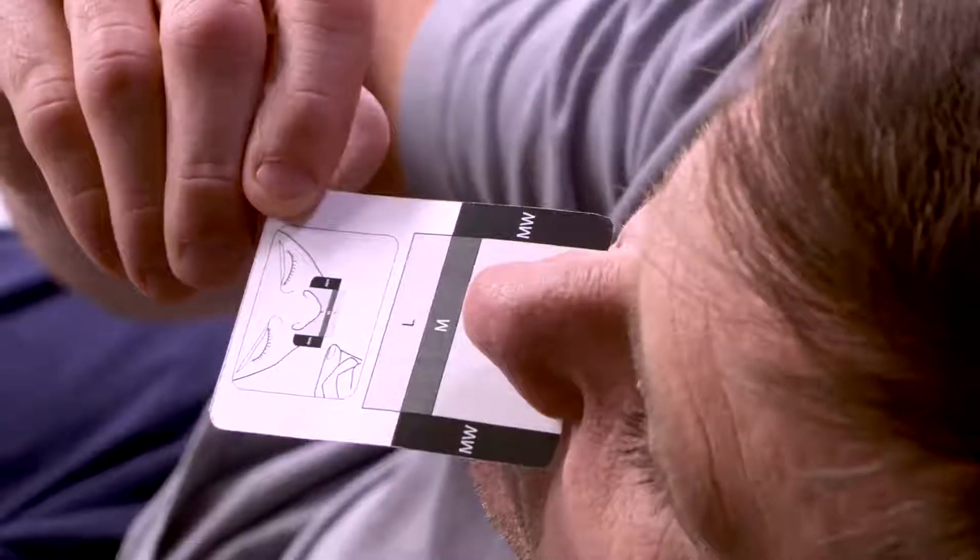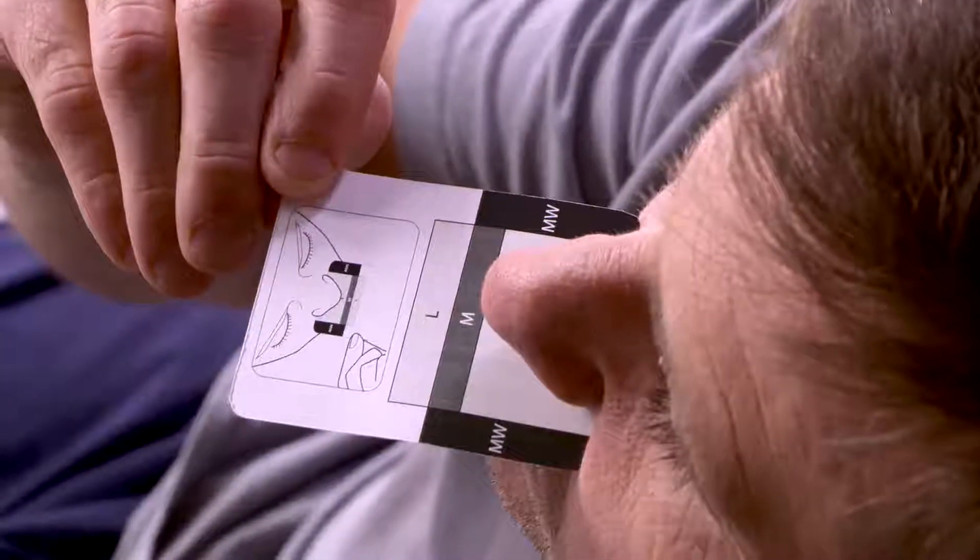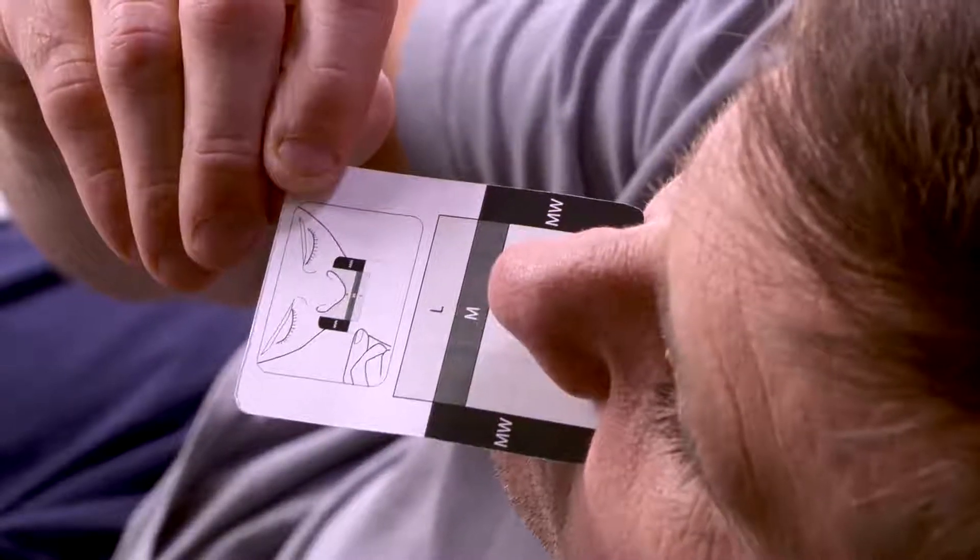To determine which size cushion is best for you, hold the cushion sizing gauge horizontally under your nose. Pick the smallest size that extends beyond the outer edge of your nostrils and the tip of your nose. This person is a medium.